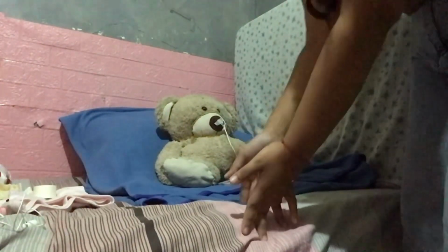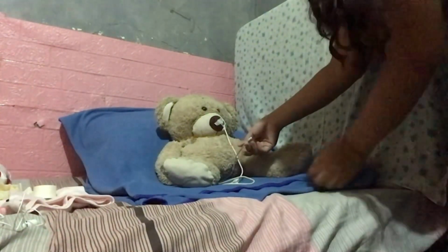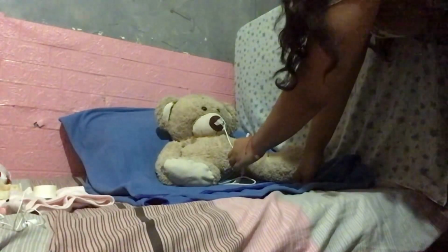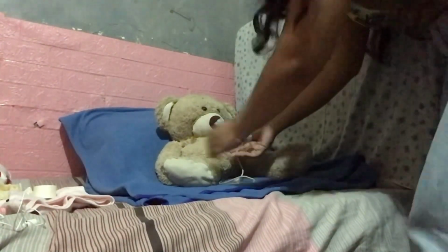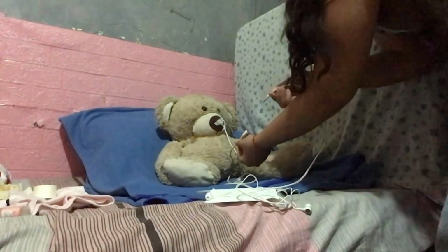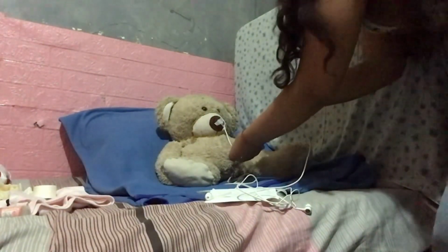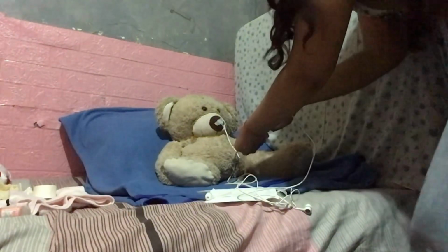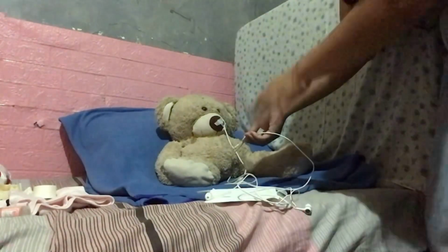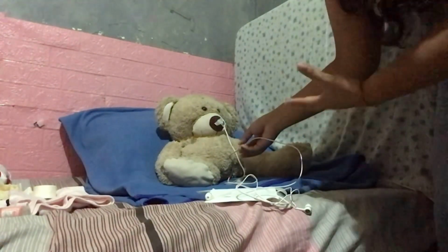Next is inserting the catheter. So you have to hold the penis upright with one hand. Imagine this is the penis of the patient. So hold the penis with one hand, with the other hand gently insert the lubricated catheter. So for example, this is the lubricated catheter. So just gently insert the lubricated catheter into the urethral opening like that, and then advance the catheter slowly and steadily following the natural curvature of the urethra. If resistance is encountered, pause and gently rotate the catheter until the urine drains freely into the collection bag.